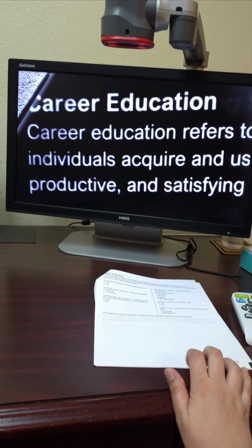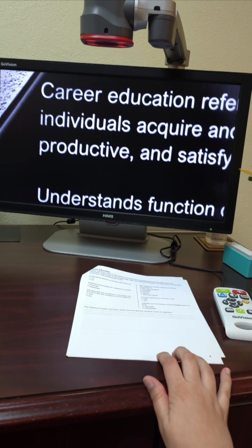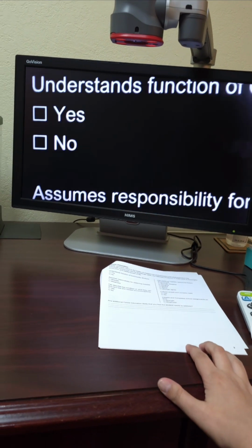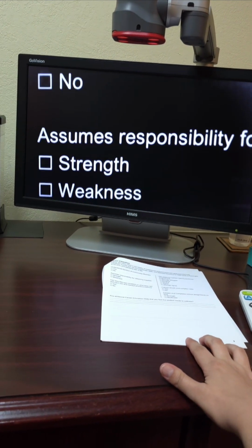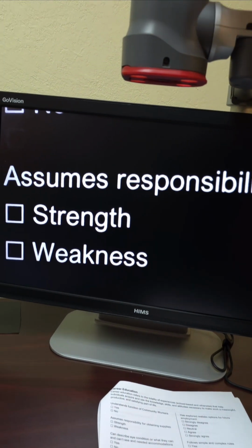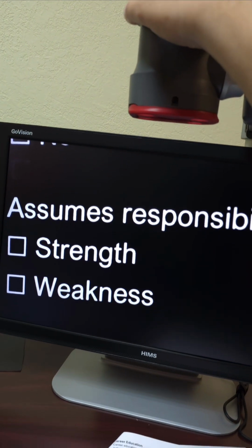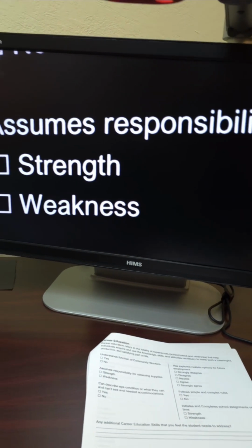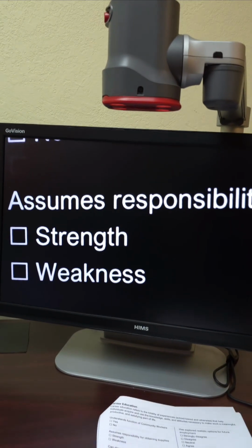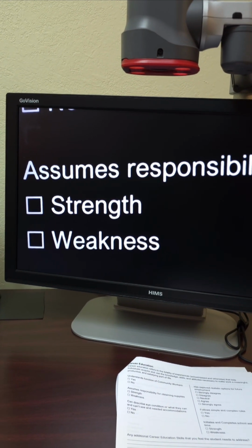But yeah, this is pretty cool stuff. It's very helpful to me. It really helps me do my job and also do my hobbies a lot easier. I'll show you one more thing. So I'm gonna push this button up here. I could always just find the button on the remote, but I'm just so used to pushing that button up there to adjust everything. But let's use the remote just for the sake of it.